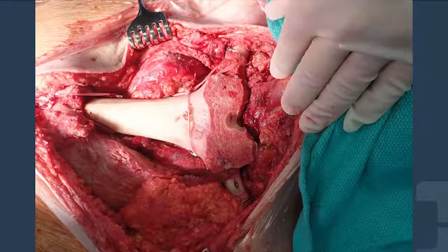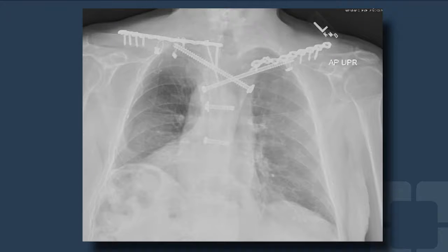this defect. Because of the limited bone fixation, we utilized multiple orthopedic principles to help gain fixation, including plating, long cannulated screws, and suspension with strong suture material. The graft was also supplemented with bone cement to increase its strength, and all of the junctions were bone grafted.